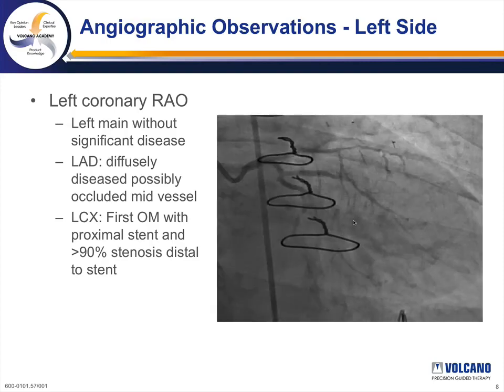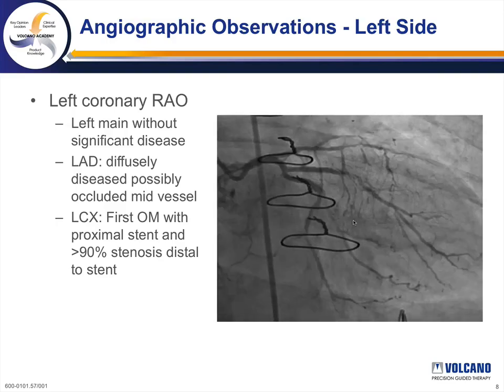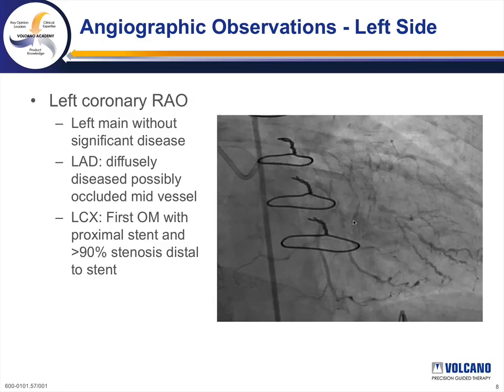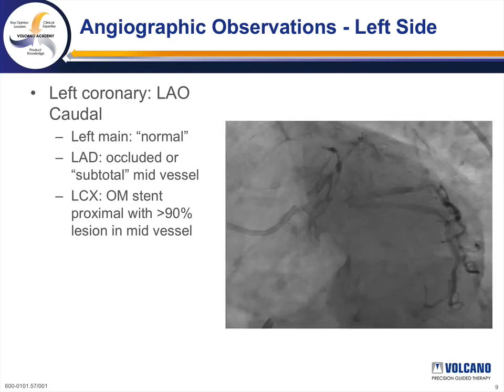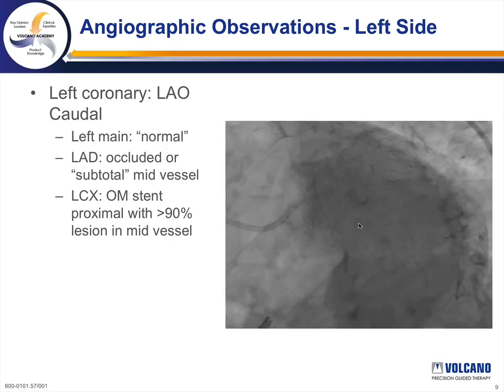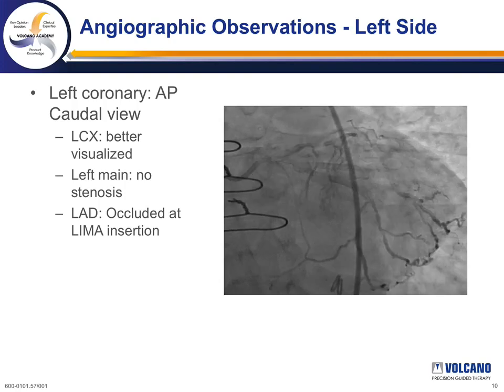She underwent angiography. Images of her left coronary system showed the left main to have no significant disease. The LAD appeared to be diffusely diseased on the RAO view, and the circumflex showed a stent in the first obtuse marginal branch with greater than 90% stenosis distal to the stent. In the LAO view, the diffusely diseased LAD was still evident, the left main had very mild disease, and the obtuse marginal branch stenosis appeared more significant. In the AP caudal view, the obtuse marginal branch stenosis was better visualized.